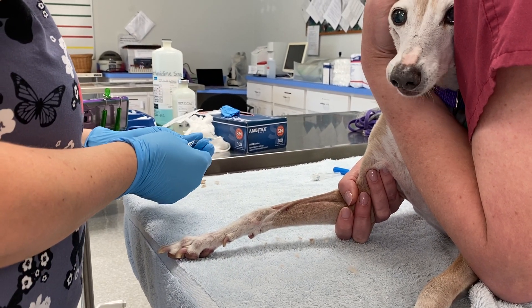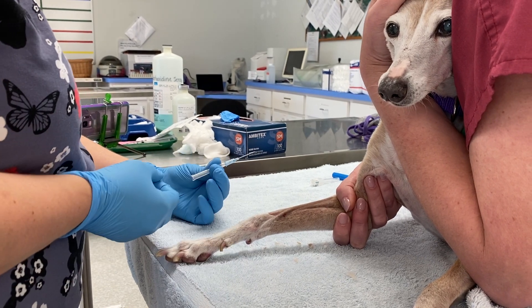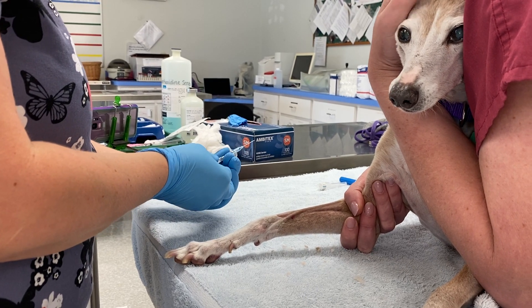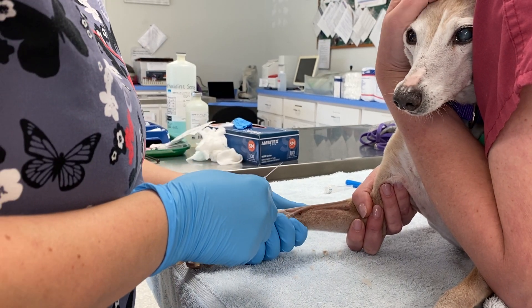I've selected a 22-gauge catheter for her. I've loosened the catheter on the needle — I didn't pull it off so I don't put a snag in it. And I've loosened the temporary cap and put that back on. You don't have to use the temporary cap, but it's a nice, convenient way to do so.